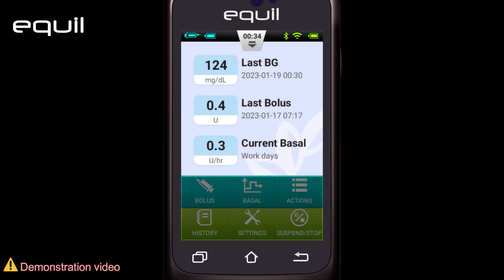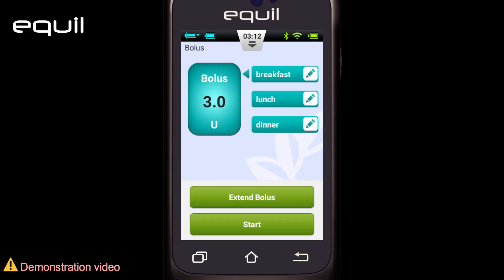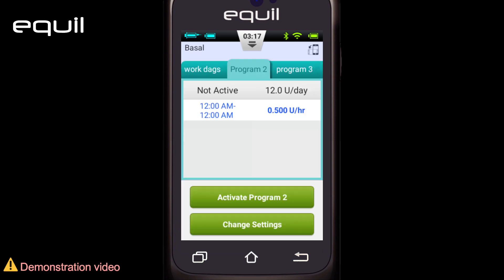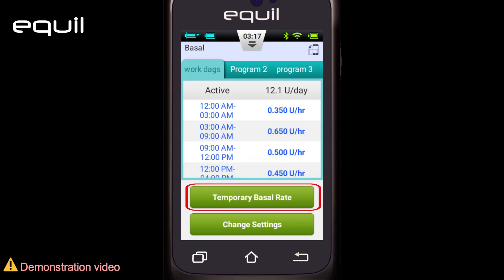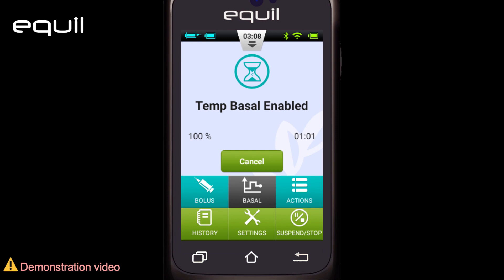The lower part of the home screen contains buttons for a variety of functions. First, the Bolus button: pressing this takes us to the bolus screen where we can administer a normal or extended bolus — this will be explained in detail in a separate video. Second, the Basal button: by clicking it, we can set the basal programs or start a temporary basal rate. You can refer to the basal video for more information.